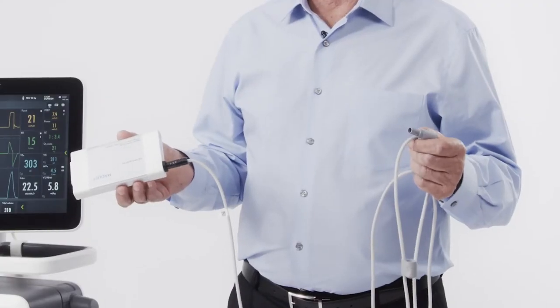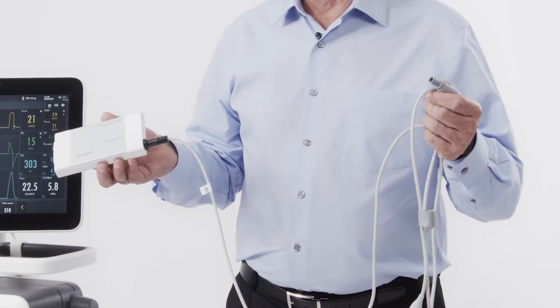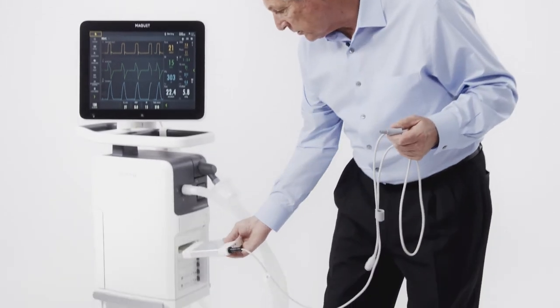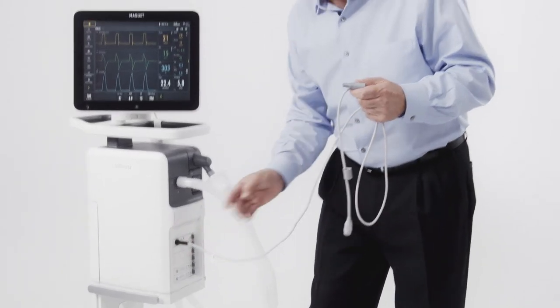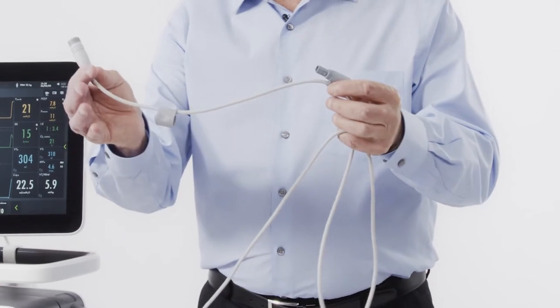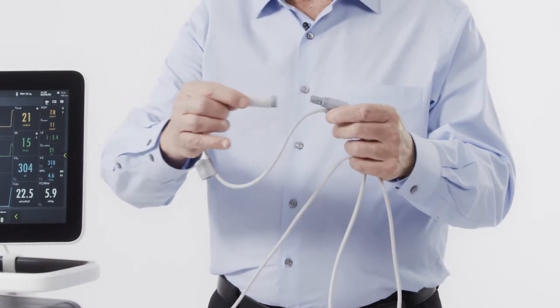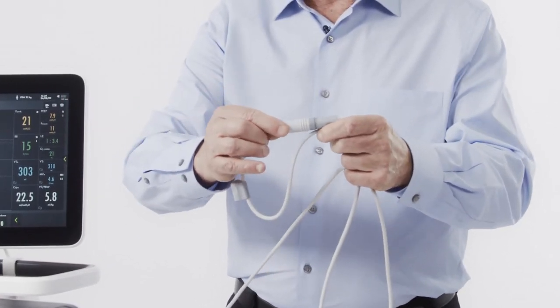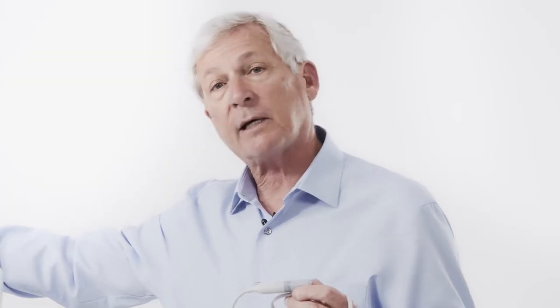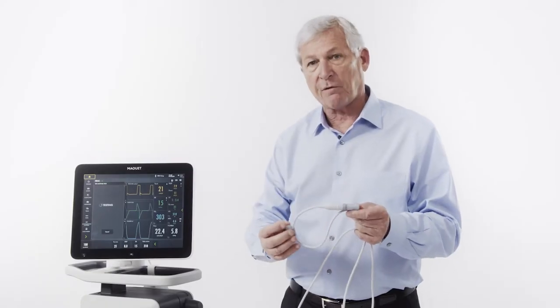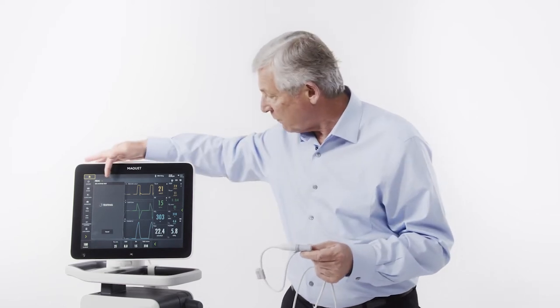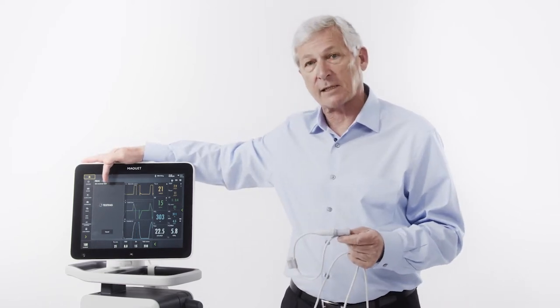We will now be required to perform an EDI module function check. We'll do this simply by inserting the EDI module into the ventilator, taking the NAVA cable and plugging it into the test port. The ventilator will recognize that we have plugged this into the test port and it will automatically perform the function test. It will also inform us that we've passed the test.